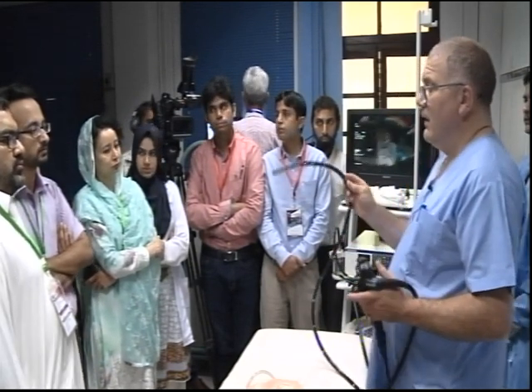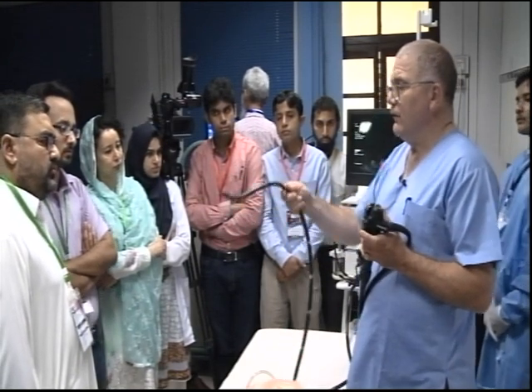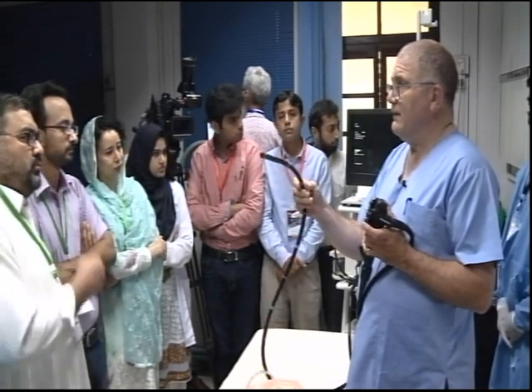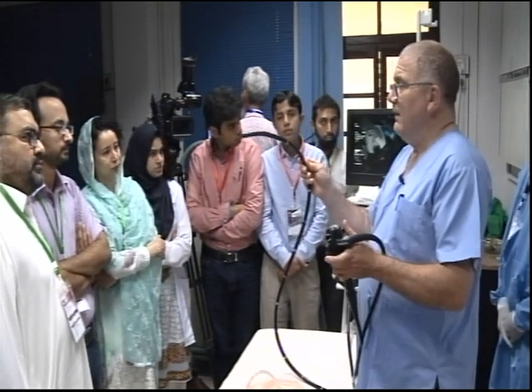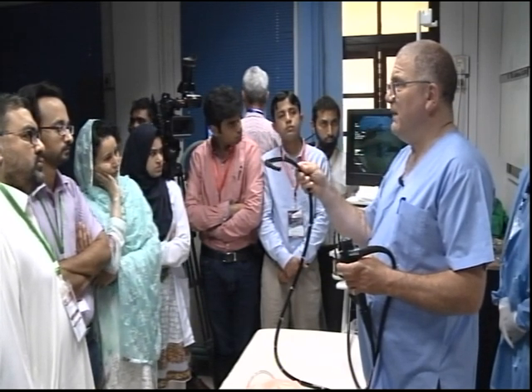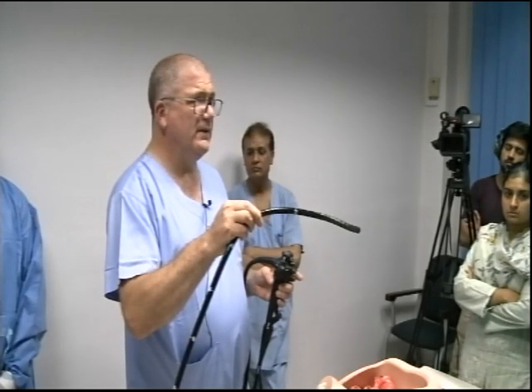Can you go over it? So, when the big wheel is back and neutral, if I go clockwise torque, on the screen it'll look to the right. Anti-clockwise, it'll look to the left. Same here now. If I pull the big wheel back, even though it's gone up on the screen, if I go clockwise torque, because the tip is down, it'll go to the left. Anti-clockwise, it'll go to the right.